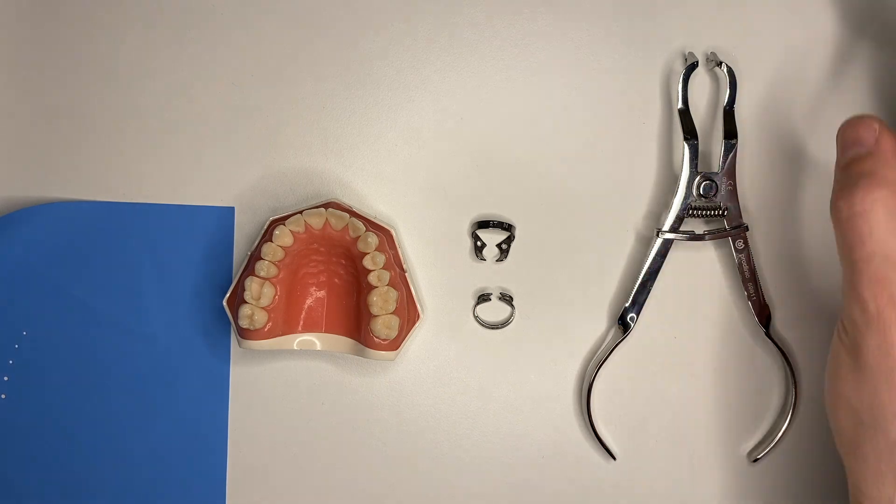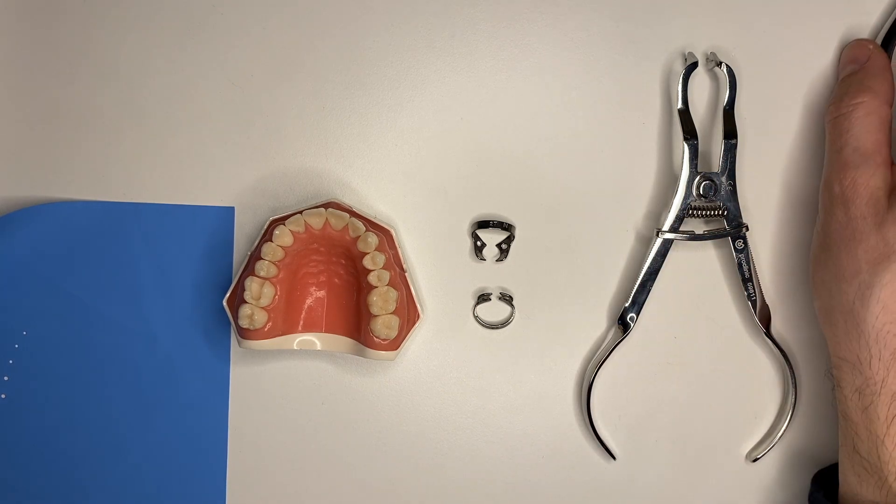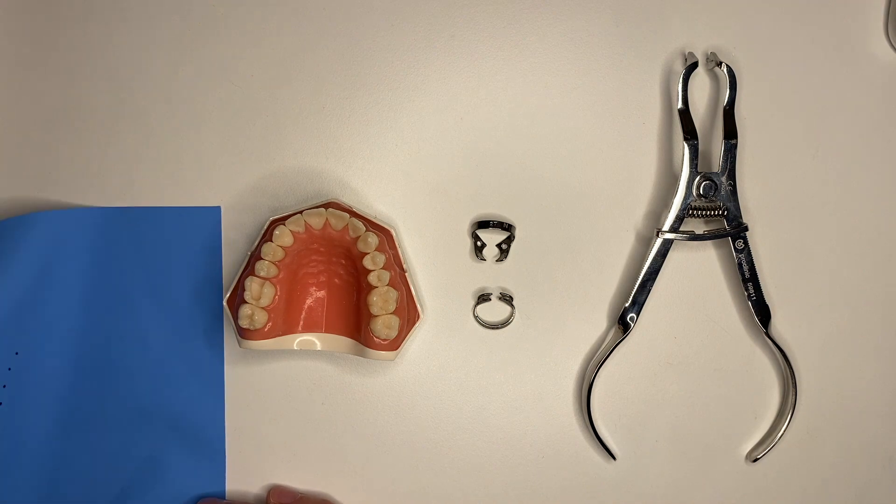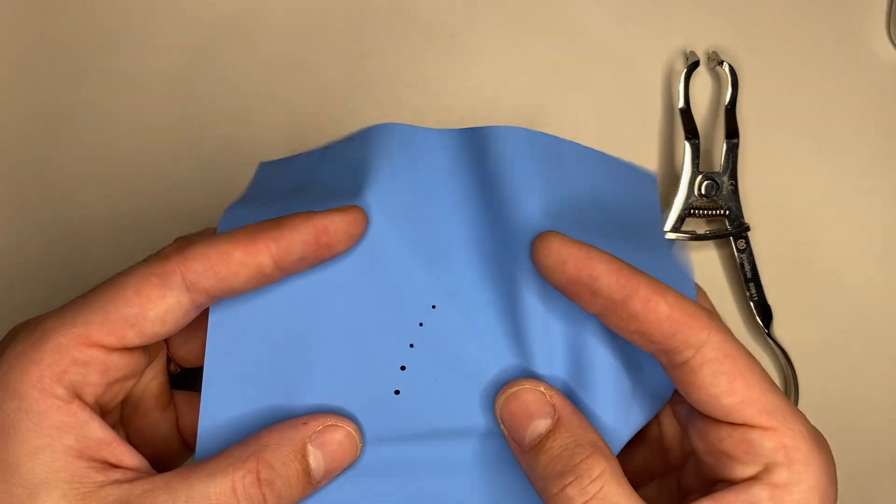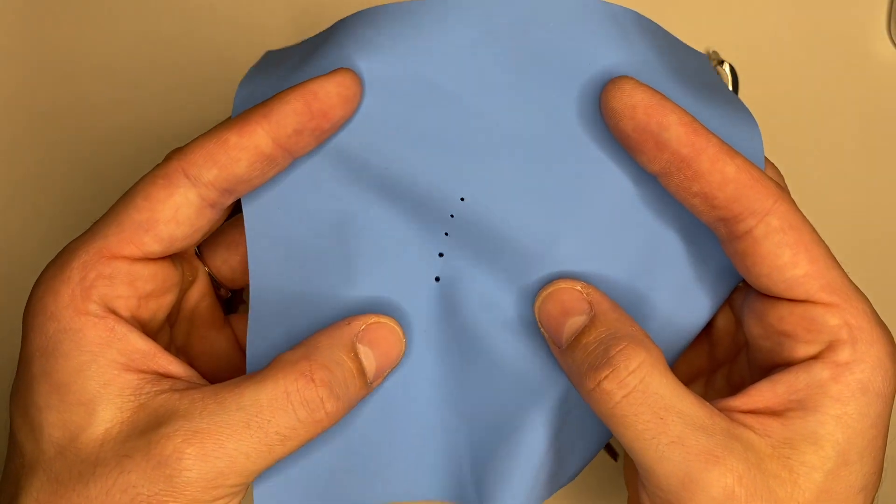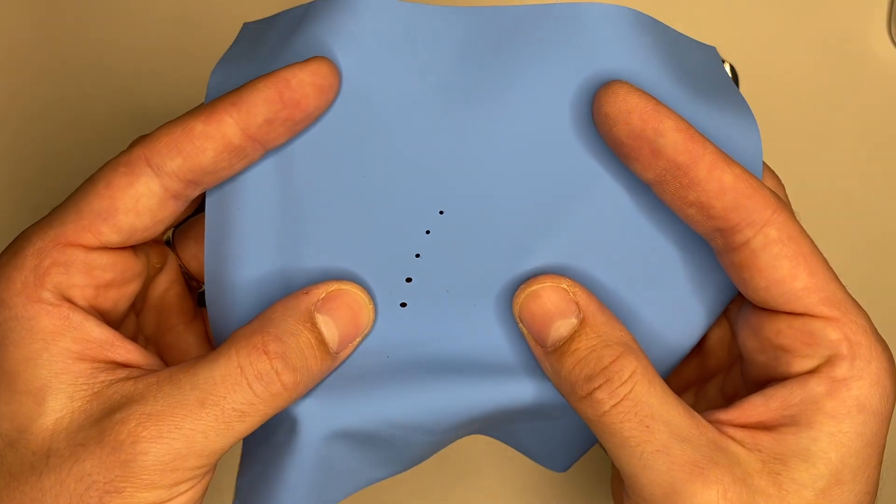You're going to ask why I decided to go so far with the isolation. I usually do this in the office. If I'm going to work on a single molar, I'm most likely going to isolate an entire quadrant and then some. This is good practice.